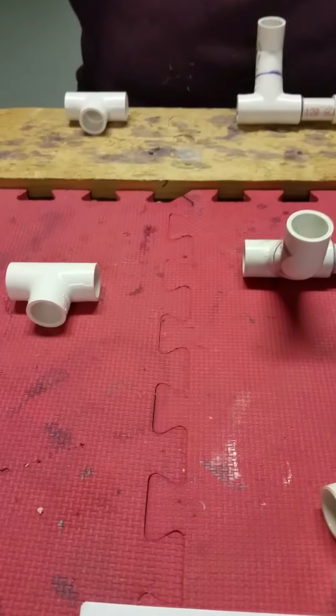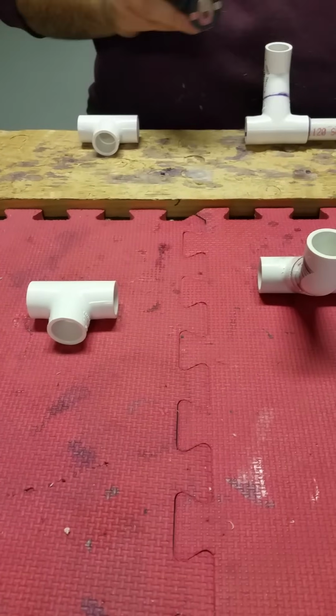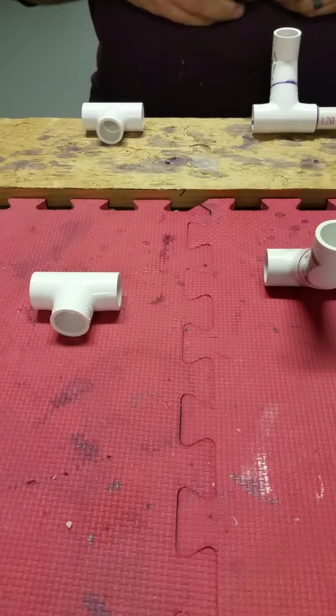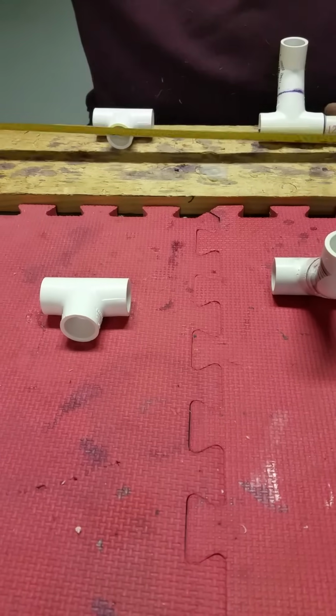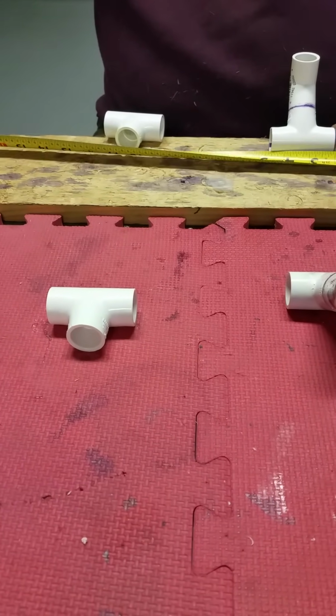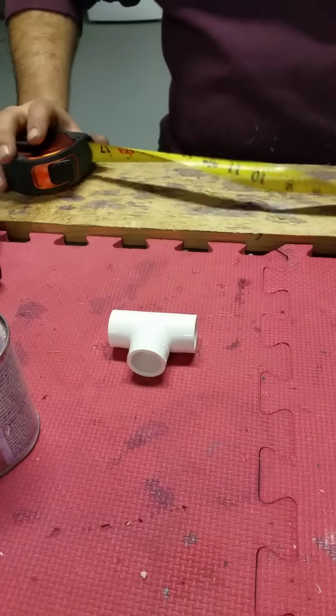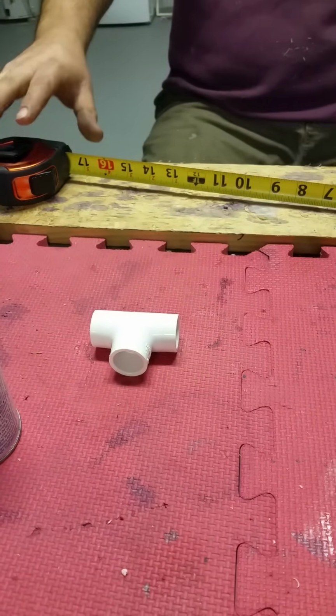Next, we're going to be figuring out how long the arm pieces need to be. And since this is a bigger cart that we're building, we're going to have the belly bar on it. So we need to figure out where we want the belly bar to sit. And ideally, you want it to be at least 5 inches behind the front legs.